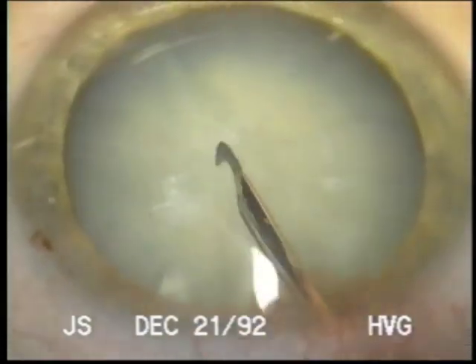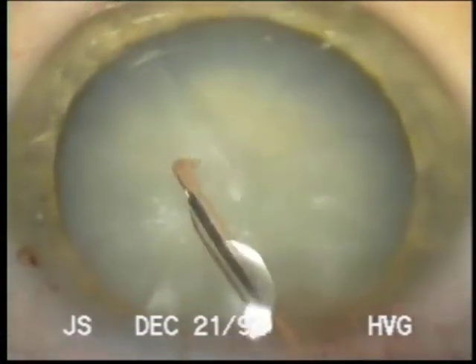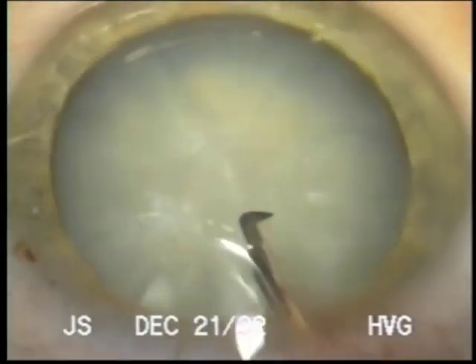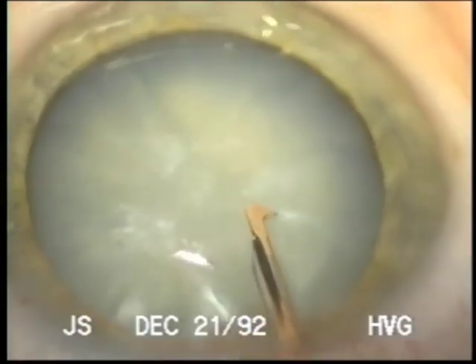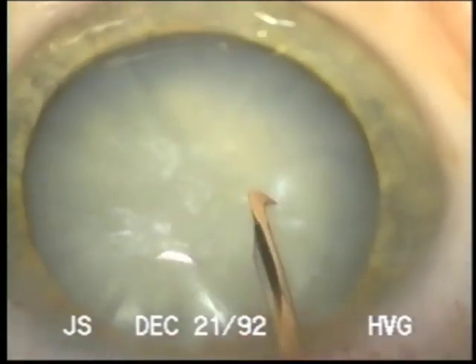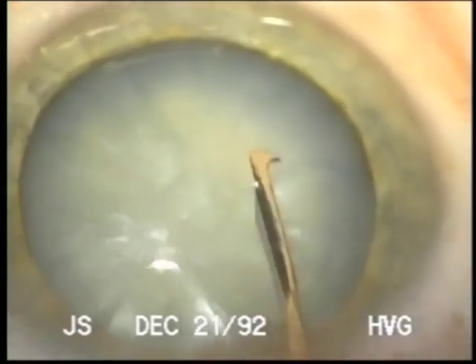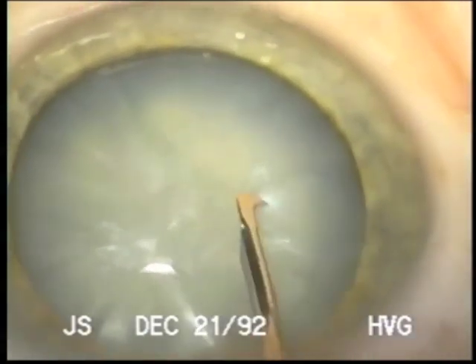The sub-incisional ones are the most difficult to tear in that direction. So you can see I'm pushing away from me. I've had a lot of young surgeons and residents say, well, what's a can opener capsulotomy?